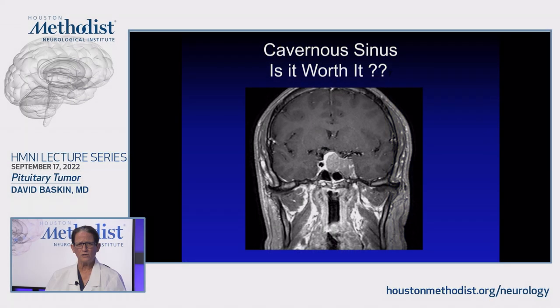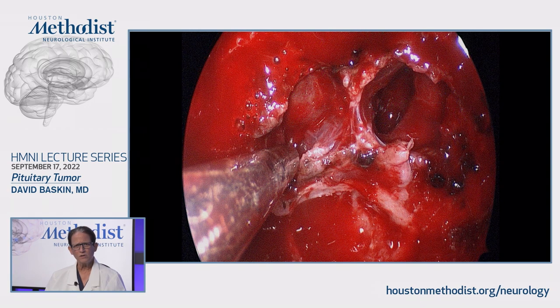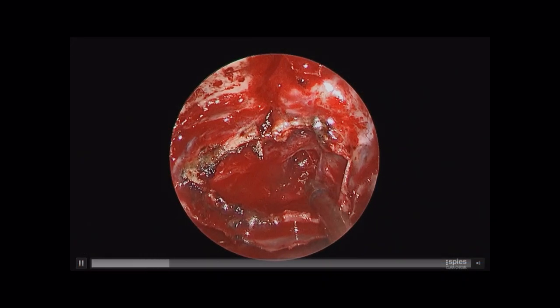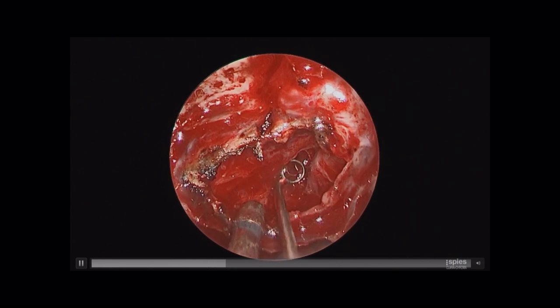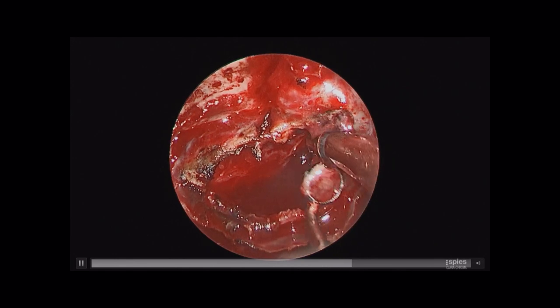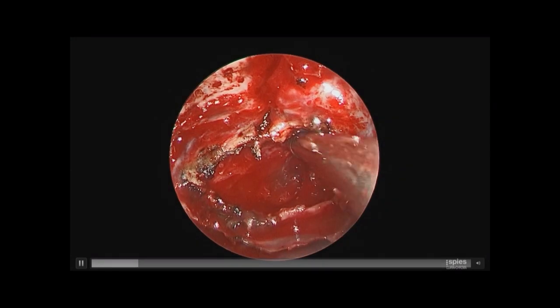Here's a patient where you look at the imaging and say 'oh my god, this is terrible cavernous sinus invasion — I'm never going to be able to get it out.' Here's what it looks like in surgery. You can see the sella and the wide exposure of the cavernous sinus on the right. With just a little bit of work, you can see the carotid very easily in the middle of the cavernous sinus — the medial compartment and the lateral compartment. With just a little patience and flow seal, the cavernous sinus is no longer a no man's or no woman's land unless you get far out laterally where the cranial nerves are. Working lateral to the carotid, you can reach underneath and on top of the carotid and pull out tumor in the cavernous sinus.